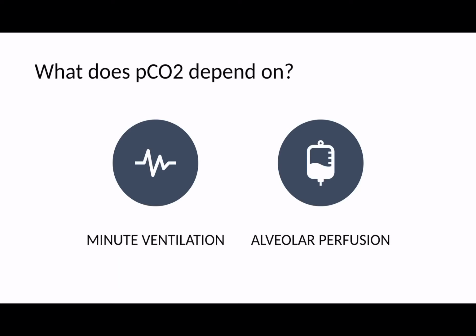It's also worth considering carbon dioxide removal. Now, for most people with spontaneous breathing, what you're getting is the normal breathing in and out, the tidal volumes, and this is what removes the carbon dioxide, the so-called bulk flow of gases.